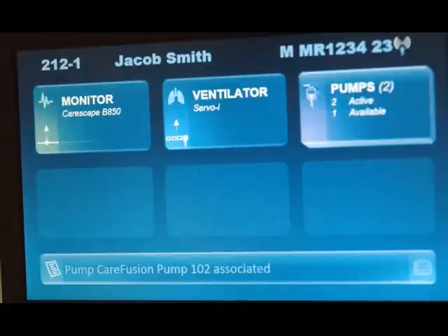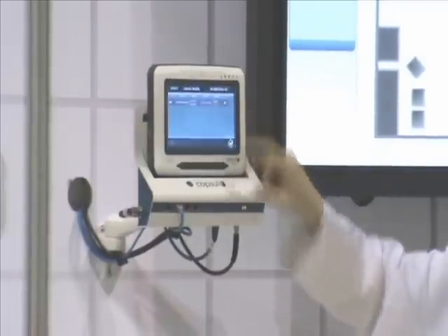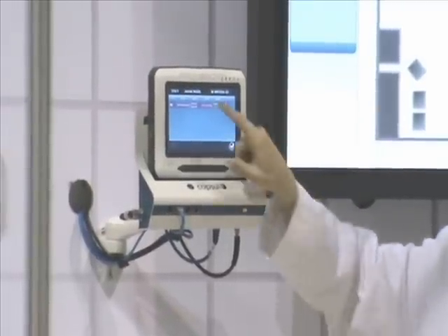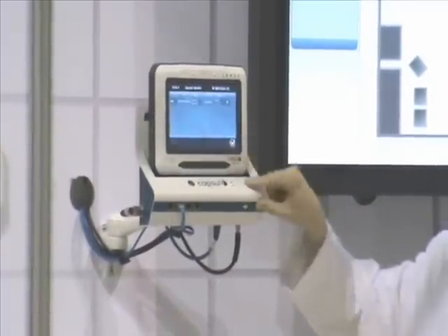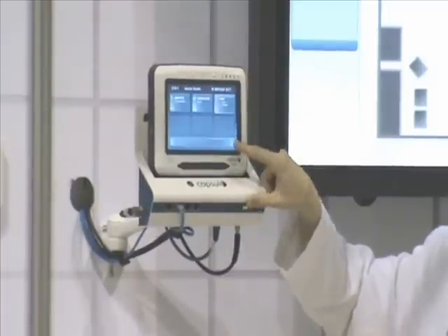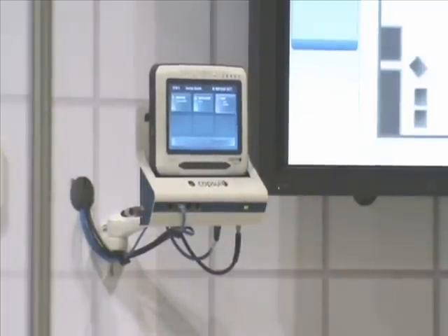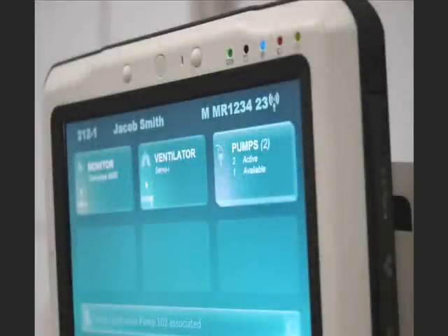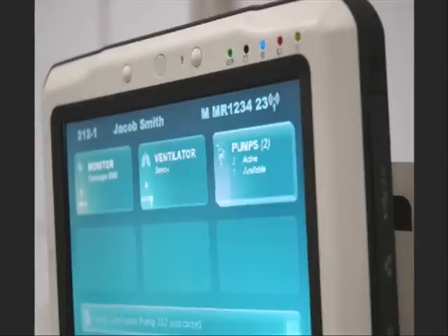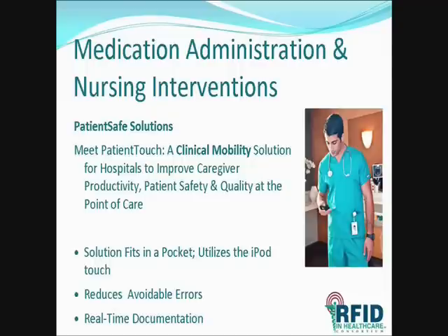To show how ad hoc associations are handled, I will next associate a wireless IV pump to the patient by confirming it here on the screen. On the large display, you will notice the status of the pump device changes from available to unavailable. This is based on the fact that these are now positively associated to the patient, therefore considered not available for use with other patients. There is now a positive association established, and the alarms from devices can be sent to the clinician's handheld devices.